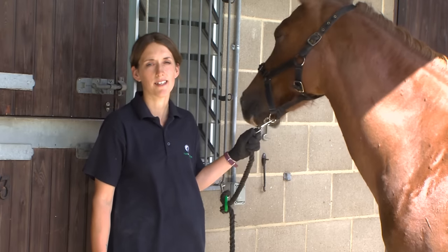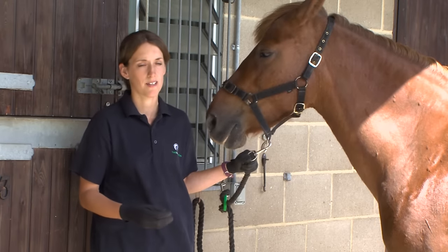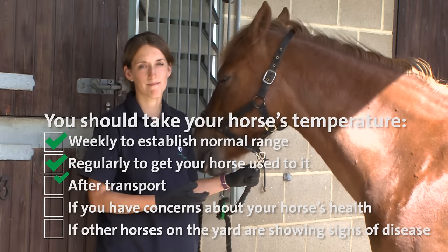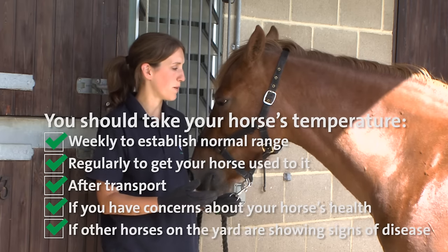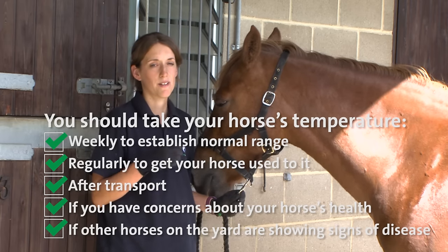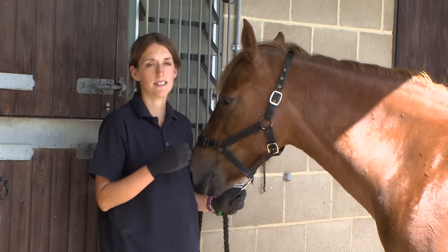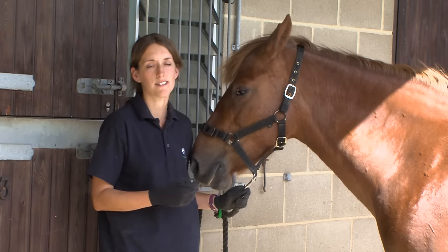Taking your horse's temperature is a really good tool to monitor their health. For routine monitoring, once a week is a really good idea to see what's normal for your horse, and if you have any concerns about their health or well-being, you could start to do that more regularly. For routine monitoring, it's really important to try and take your horse's temperature at the same time every day, at a time when they're calm and haven't performed any strenuous exercise in the last hour or so.